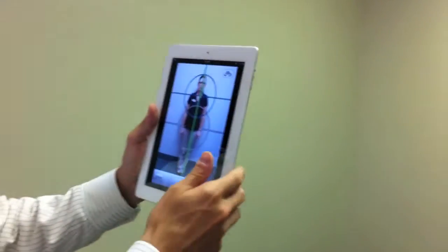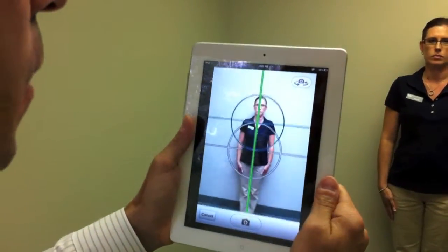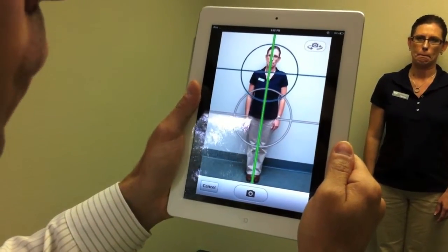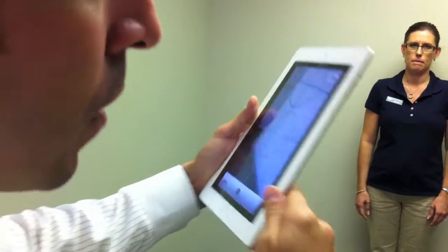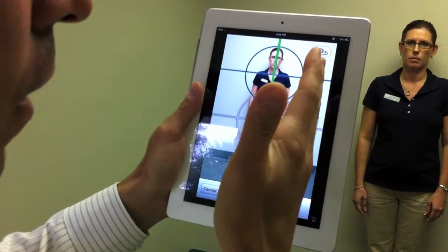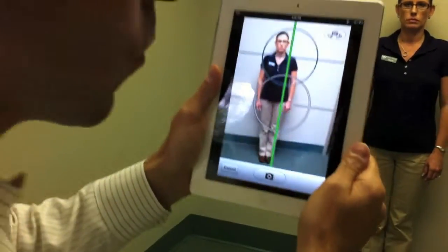We're going to come over here so I'm going to get a straight line on with the patient. You can, if you're in a rush at a screening, have the device tipped down like this. But notice how her torso is disproportionate to her feet because obviously the device is tipped this way. So common sense would dictate that we want to not only have it vertical, but we want to get on her knee and do mid-pelvis with the camera.